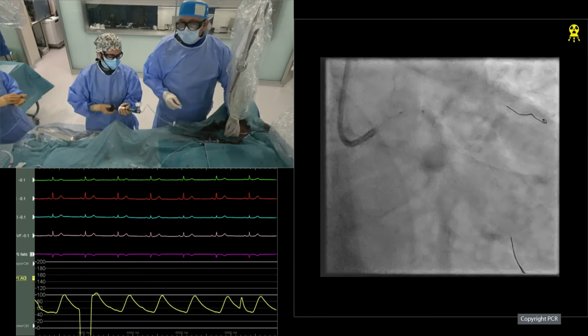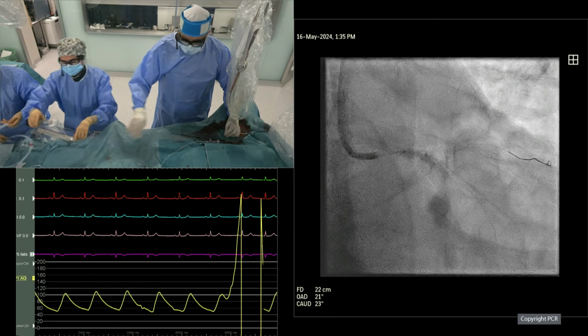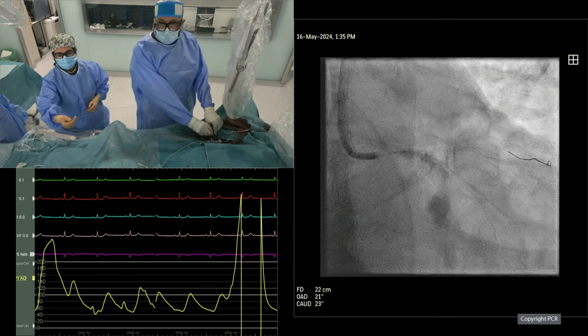Sure. So, can I make a comment? Of course. Yeah. I fully agree with the idea of using imaging. Hopefully we have convinced you that we do a lot of imaging, invasive and non-invasive. But I'm a CTO operator, and in CTO operators, we use a term that is called do not stay in failure mode. So we first try to do exactly what Florin was suggesting, make kissing.